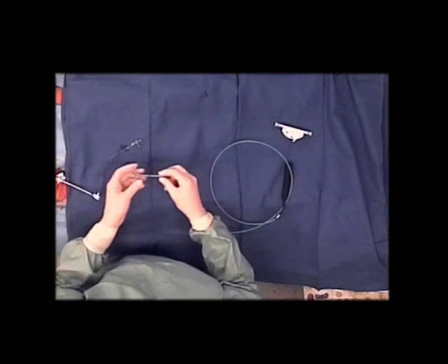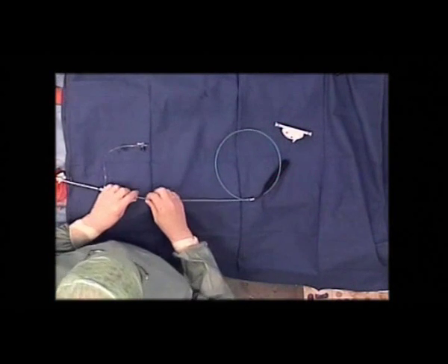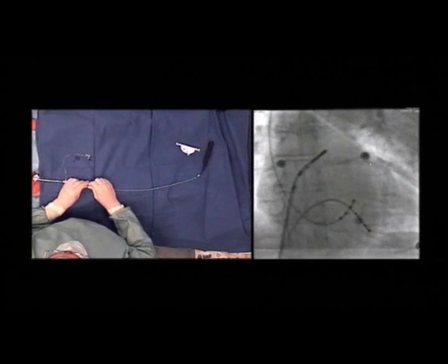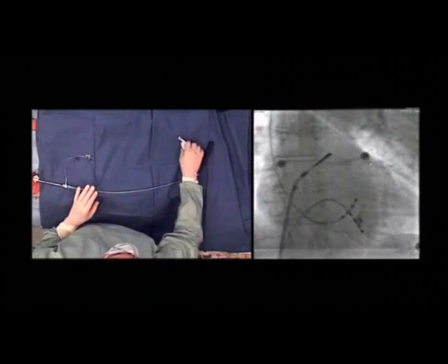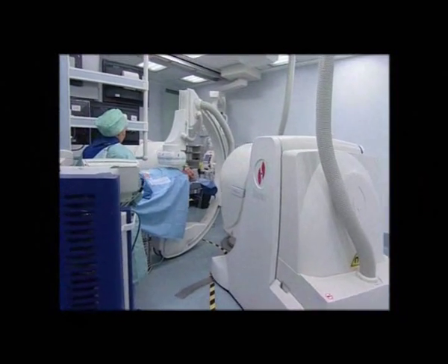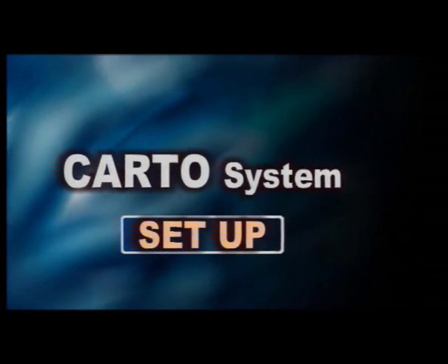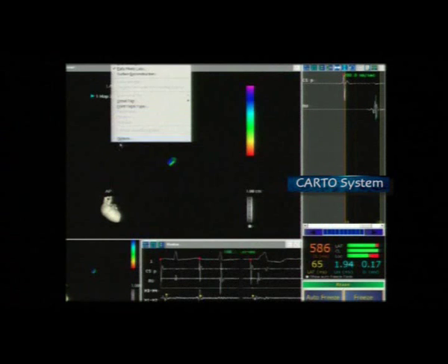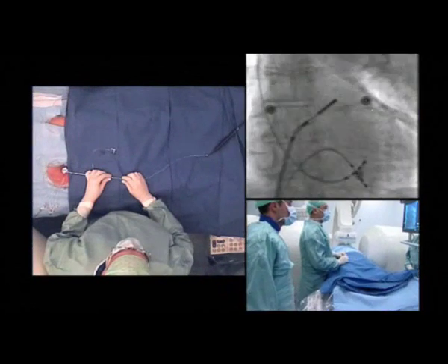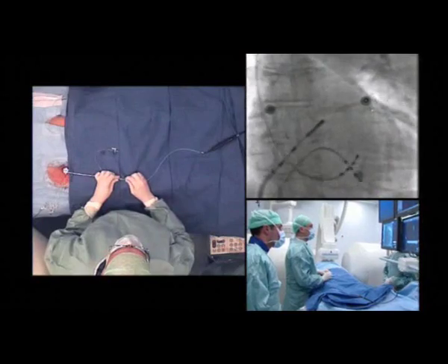We use this device to advance the catheter to cross the valve and advance the catheter to the left atrium, just outside the introducer. We will now bring in the magnets. The remote navigation system uses a 3D geometry as it is integrated with the Carto system. The Carto RMT unit is compatible with the Stereotaxis magnetic environment. The interface and settings are not different from the standard Carto system. To allow greater mobility of the magnetic catheter, the sheath is pulled back.